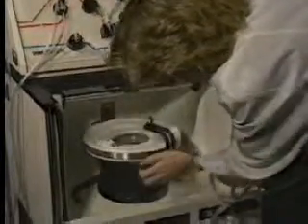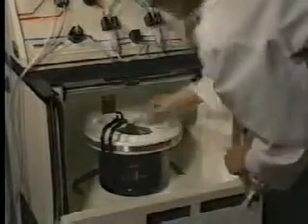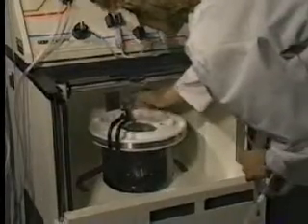Rotate the centrifuge so that the loading port is open to the front and lift the filler latch. Fold the channel in half as shown, thread it through the loading port and pull it out from the top. Using the filler slots as a guide, align the channel.